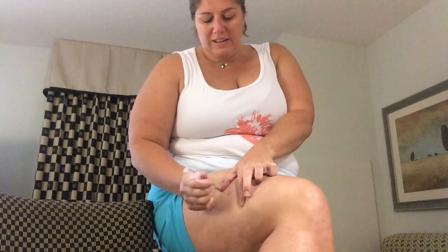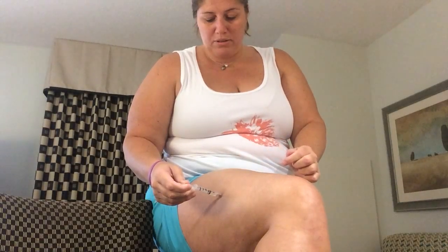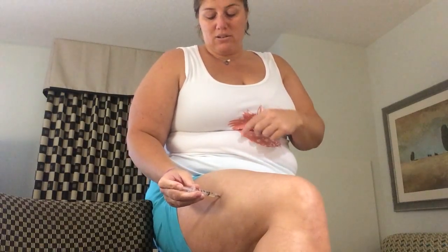So what I need to be looking for is when you straighten your leg out, you get this nice line right here. Well, mine's not a super nice line, but it's there. You want it to go about a third of the way, that middle third, right where that is, but you don't want the muscle to be flexed. You want it to be loose, and you want to give it like a dart all the way in, and then you have to pull back to make sure that you're not in a vein. And if you see blood, which I do not see blood, then you have to take it out and start over again.